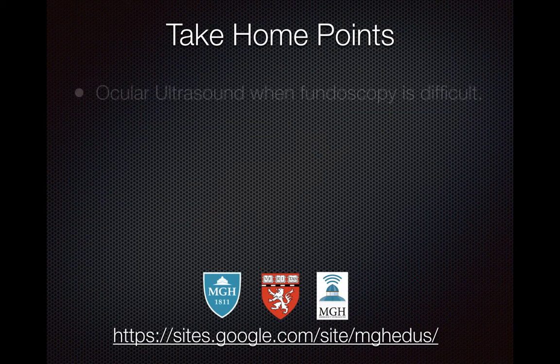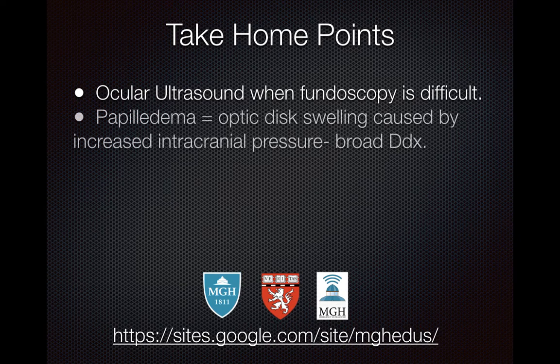So some take-home points from this case: ocular ultrasound is a great option when your fundoscopic exam is difficult or nearly impossible to perform, or if you're just not good at it, like I am. Papilledema is optic disc swelling caused by increased intracranial pressure. However, it does not necessarily tell you the etiology of the papilledema.